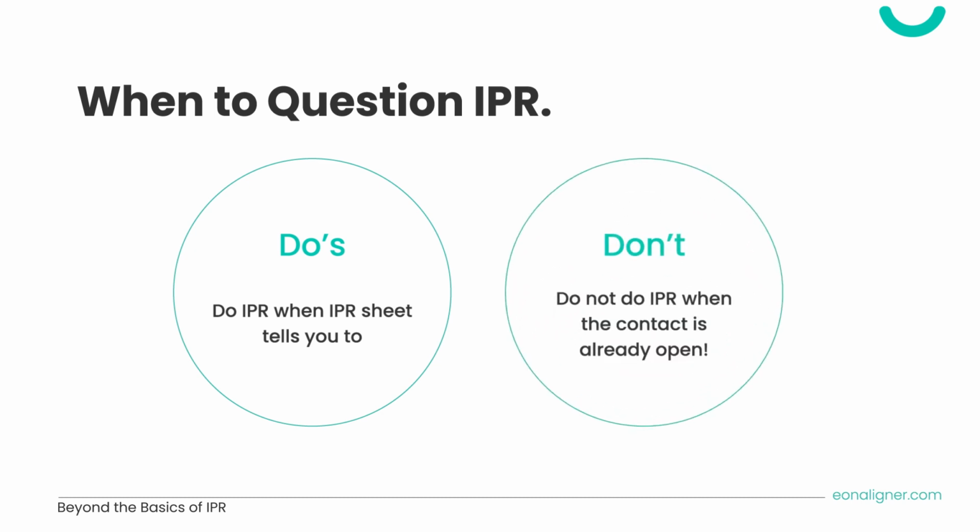But what if IPR is indicated, and when you go in to do IPR, you find the contact already open? If so, it is better to avoid IPR and keep a close watch on that contact specifically. Armamentarium. Manual diamond strips. They are for minor reductions, anterior teeth, and breaking contact points. Low-speed diamond disc. You have single-sided and double-sided discs. Also, be careful of injuring the tissues.